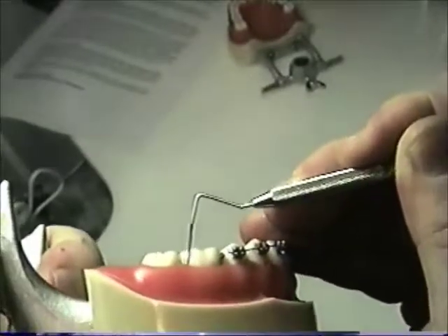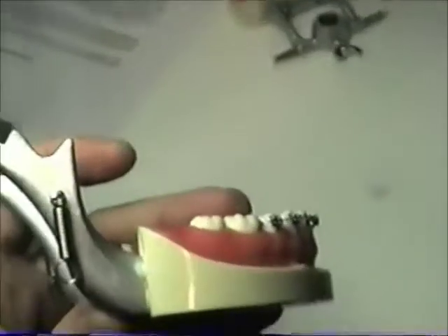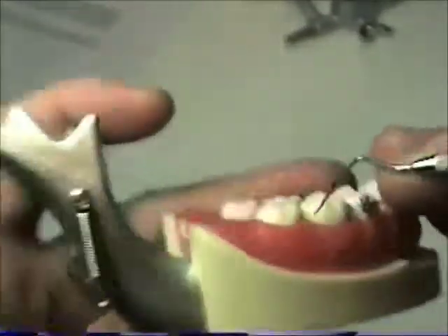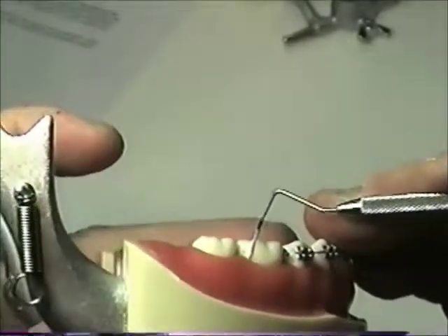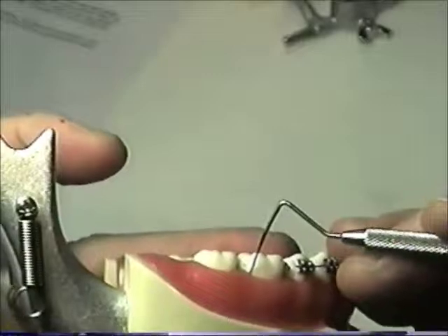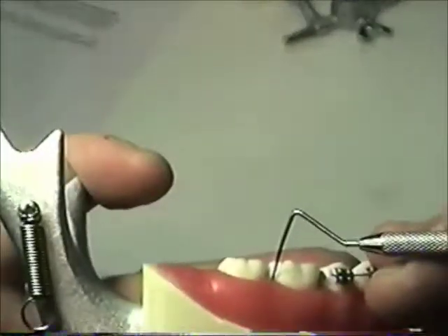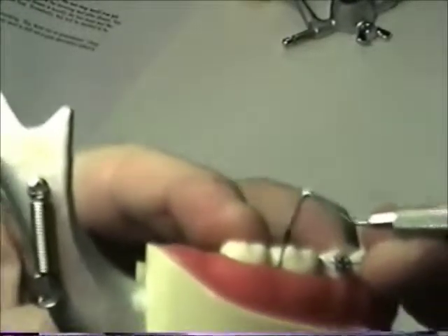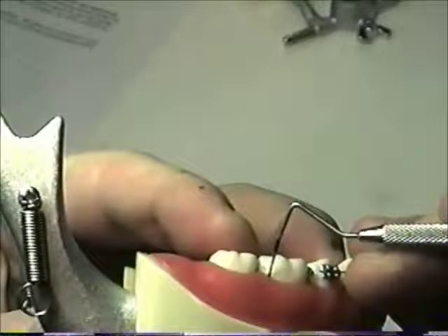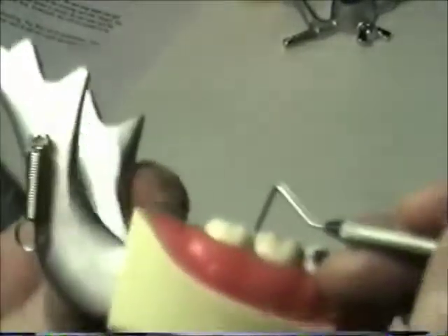But it goes up under the gum 3 millimeters to that first black mark. So it sinks in. Now over here, let me see if again we can focus in on this a little bit better. When I stick the probe in right in this area, watch this, it goes here and then it sinks all the way down into the black. So again, notice right here, there goes 3, and then it goes on even down into 5 or 6. That isn't good right there.